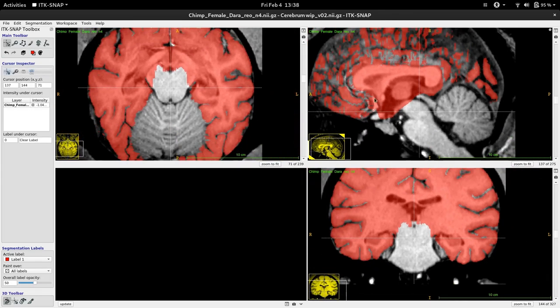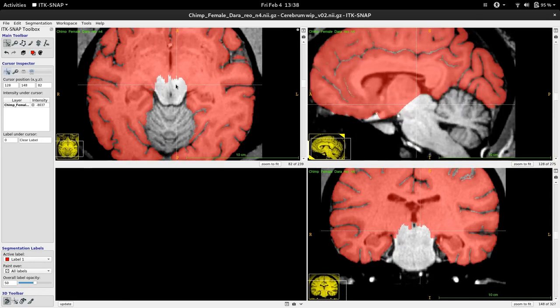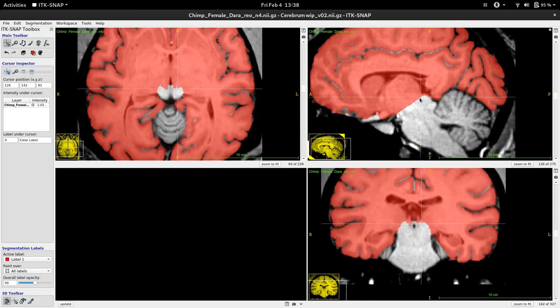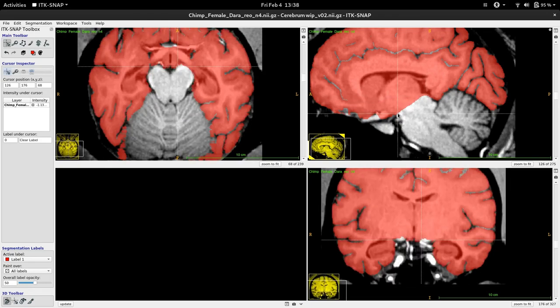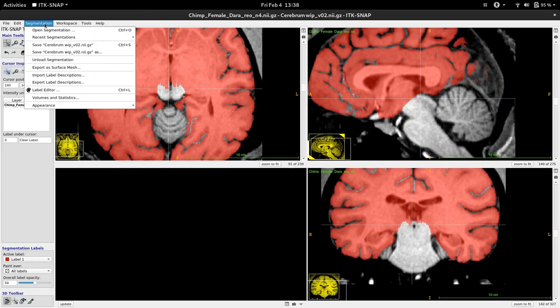At the end, the task is selecting a plane approximately orthogonal to the axis of the brainstem, the neuraxis, I think it's called, and then selecting an anatomical landmark, which is the upper part of the superior colliculus, and then more or less drawing a straight line from it that is orthogonal to the neuraxis. That's it. Okay, now I can send this to Katya.